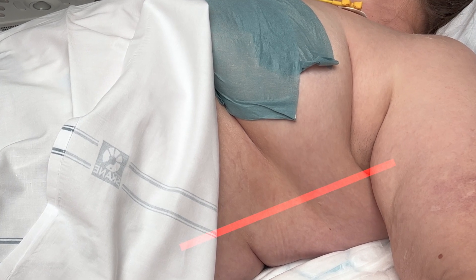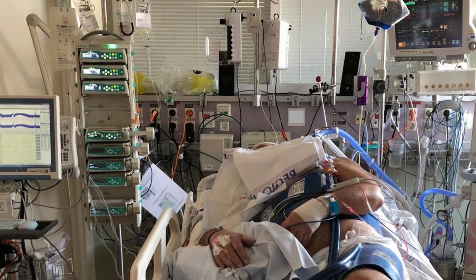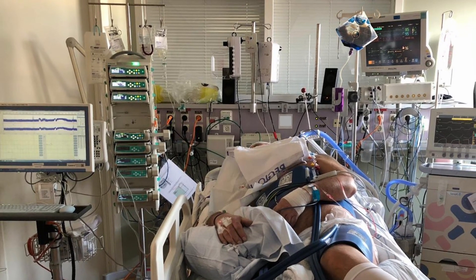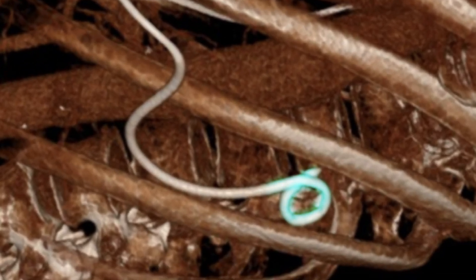The puncture will often be within the highlighted area, but the exact location is determined with ultrasound. Pleural fluid follows gravity both in the semi-recumbent ICU patient and in immobilized patients in the ward. Here's a drain with the entry site comfortably on the flank and the tip in the caudal dorsal position where the fluid will accumulate.